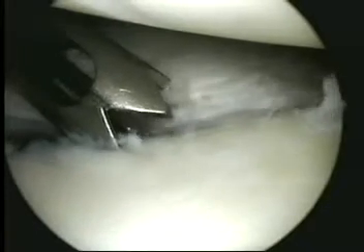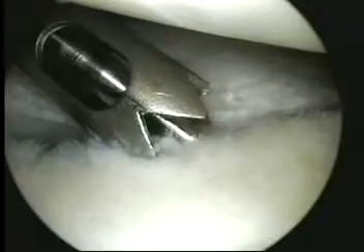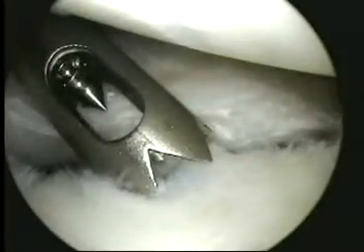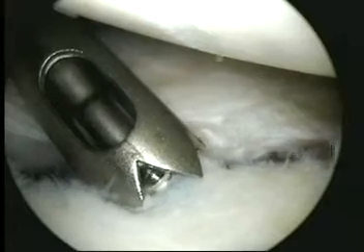In anchor-first techniques, the drill hole is once again made all the way up on the glenoid rim at the border of the articular surface. Both push-in and screw-in anchors can be used. In this case, a screw-in anchor is inserted with its attached sutures.